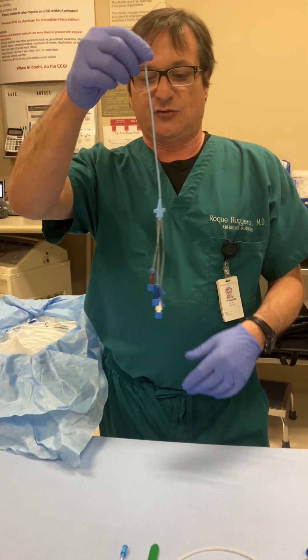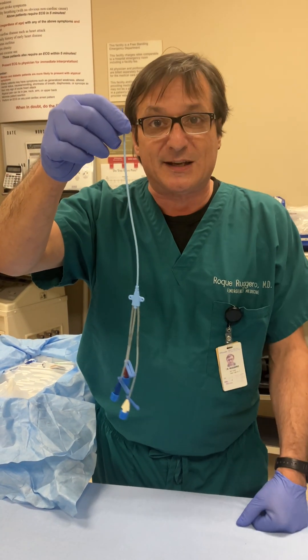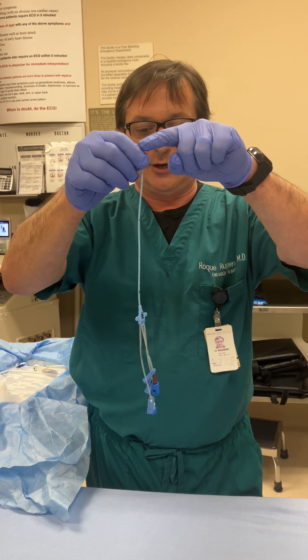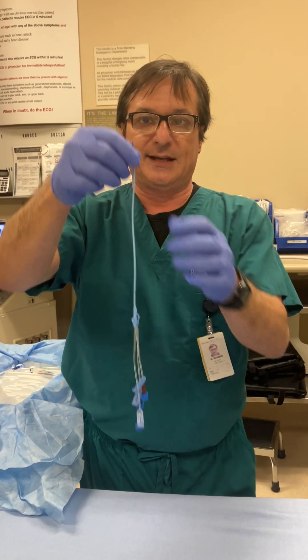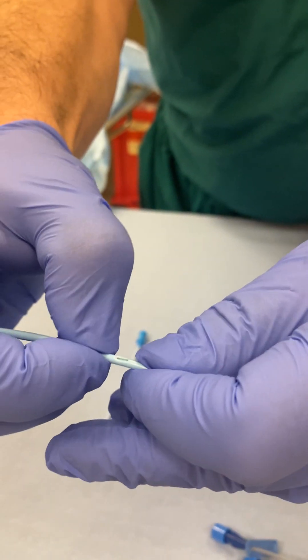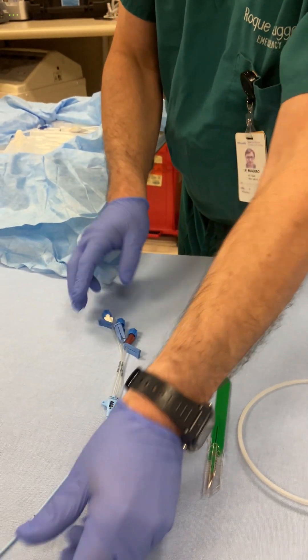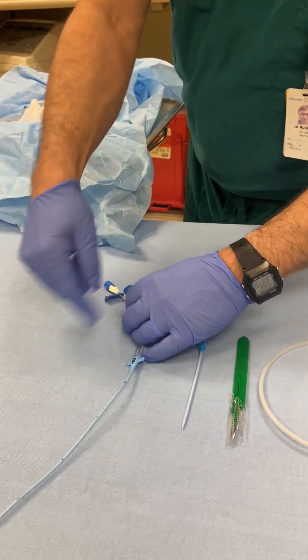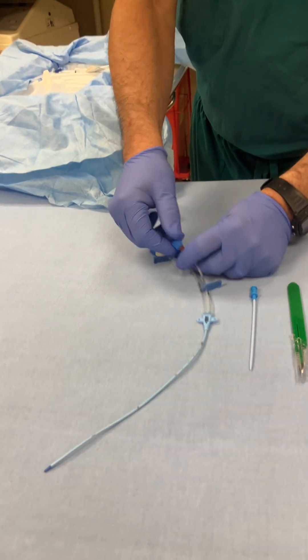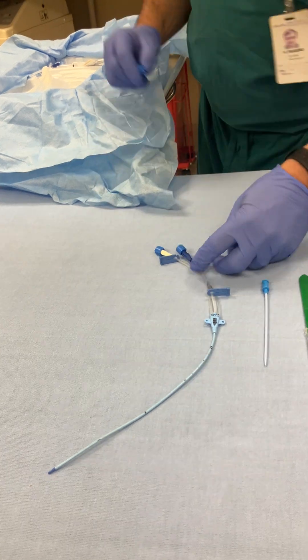One thing I like to ask students is: would you believe me if all three lumens were the same length? Obviously that would not be the case. If you look very closely, there are ports where the other two catheter lumens drain from. I'll be threading the wire through the distal port, so I'm going to remove that cover.